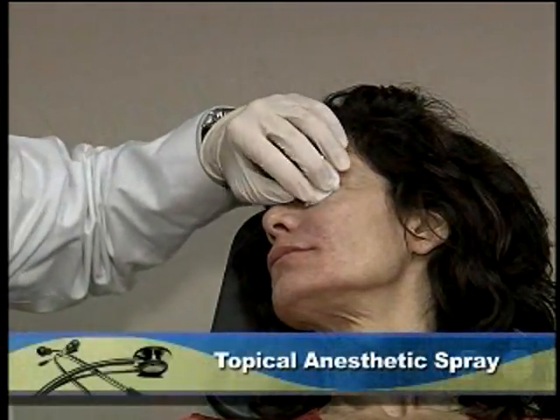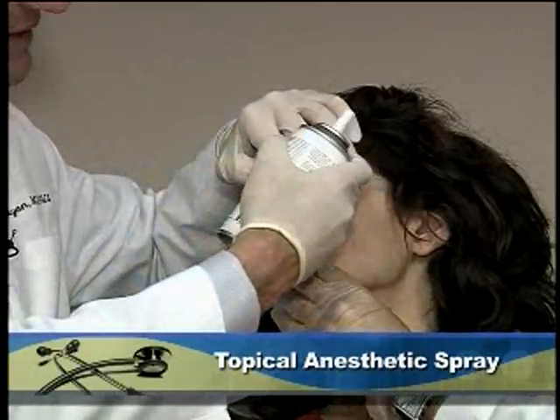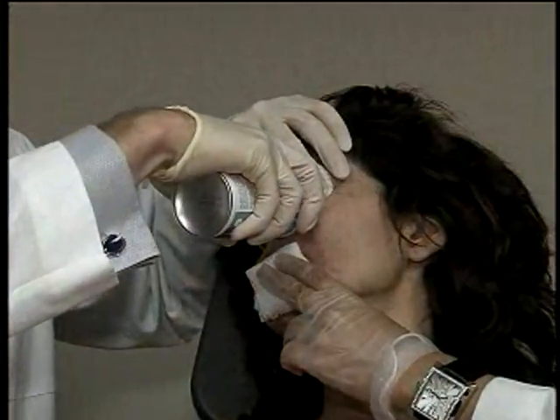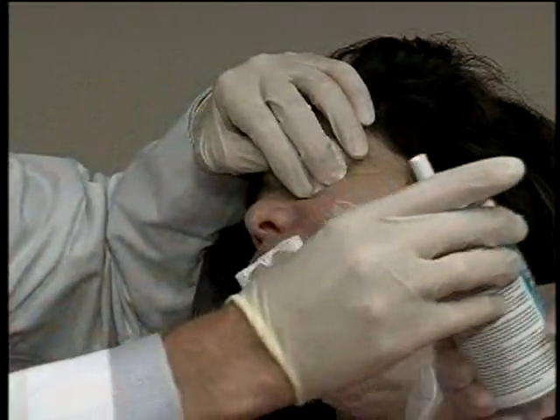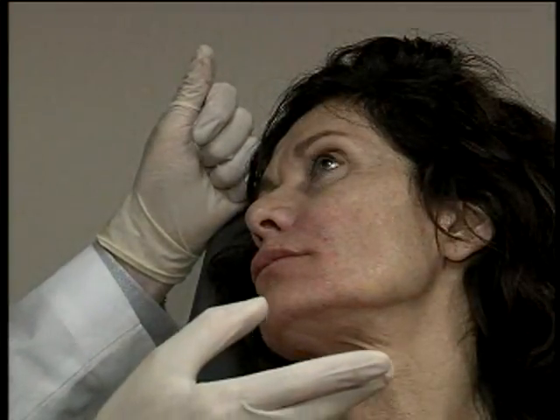And I'll cover the eye because I want to make sure not to get this product in the eye. And we may cover the corner of the mouth. And I find the area I want to treat, which I know is right around here. And this product gets sprayed onto the skin until you see a white color, like that. Okay, and then the product. Now, you have about a minute or two of it being anesthetized.